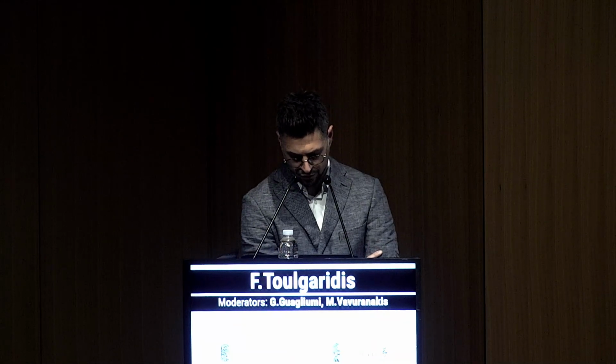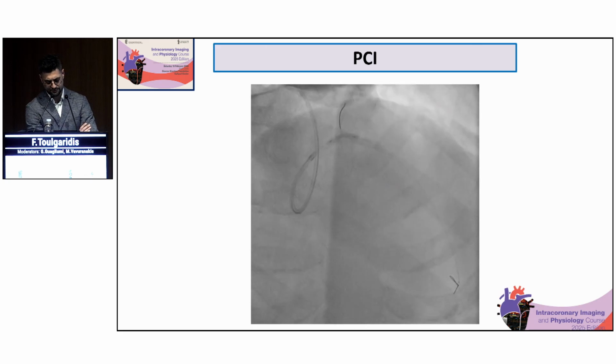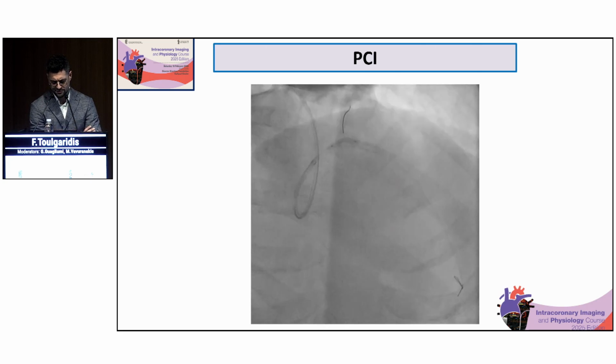Excellent opinion so far. So, as predicted by IVUS, we really had to deal with a lot of calcium regarding ostial LAD and distal left main. And this is the use of an NC 3.0 by 12 non-compliant balloon, which seems to have a dog bone effect, as you can see. And that was predicted because it had a calcium ring of 360 degrees angle arc.